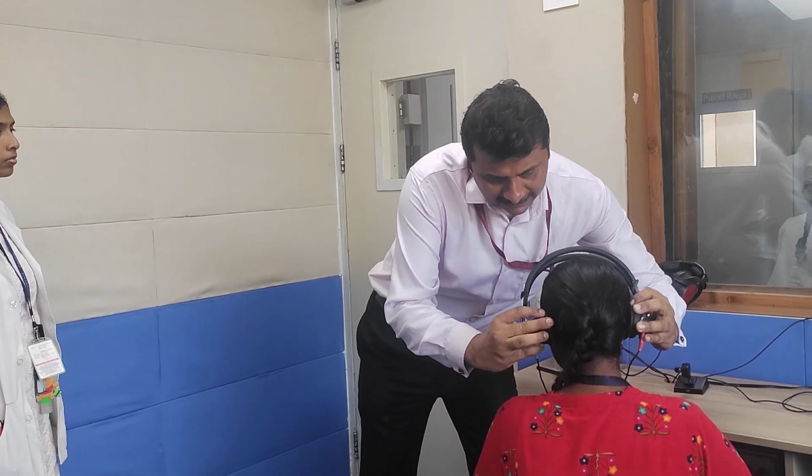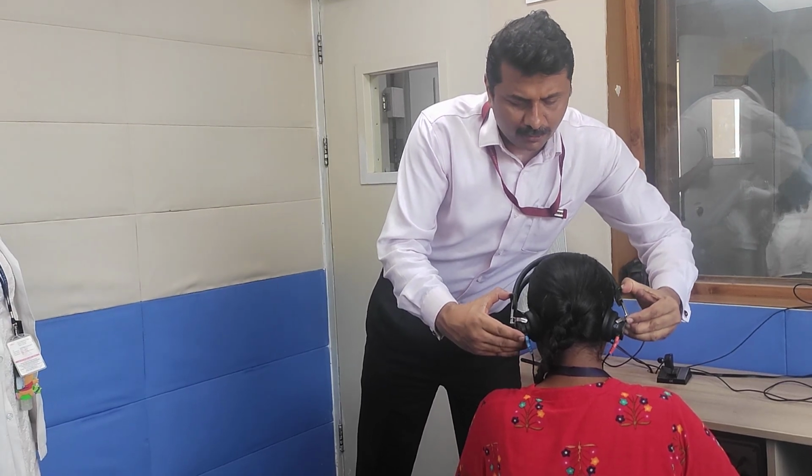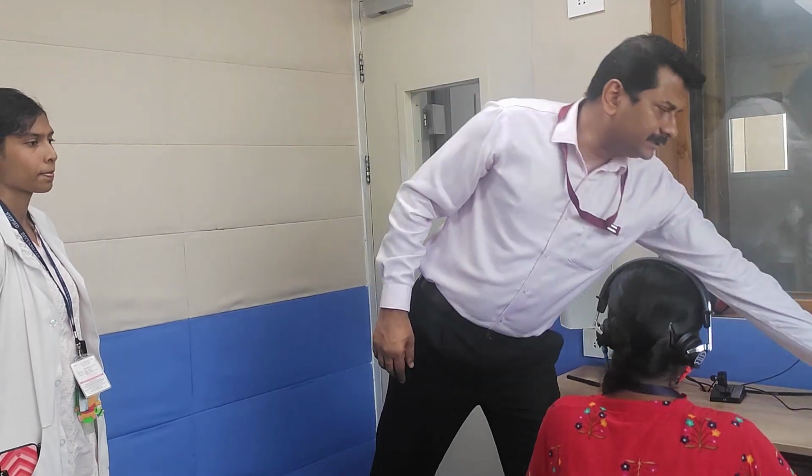So I put on the headphones like this to the center of the head. Ensure it is snugly fit, because what is the amount of pressure that should be there? 500 grams. 500 grams. Remember that. Okay? So these are basic settings which have to be done. In case the person is using the patient response switch, that has to be instructed appropriately. Press switch, release, press switch. But still I prefer the hands, because people are much more interactive and you know whether you are doing it to the left ear or to the right ear. Understood? That's how instructions are given. Done.